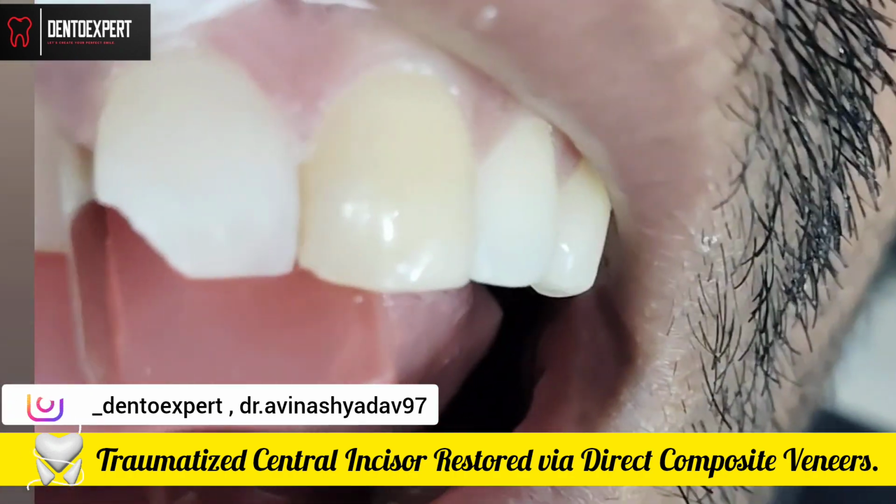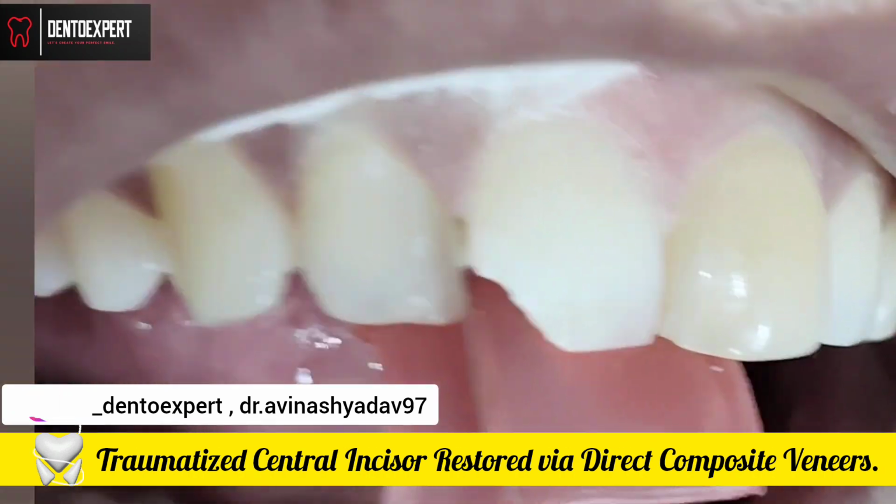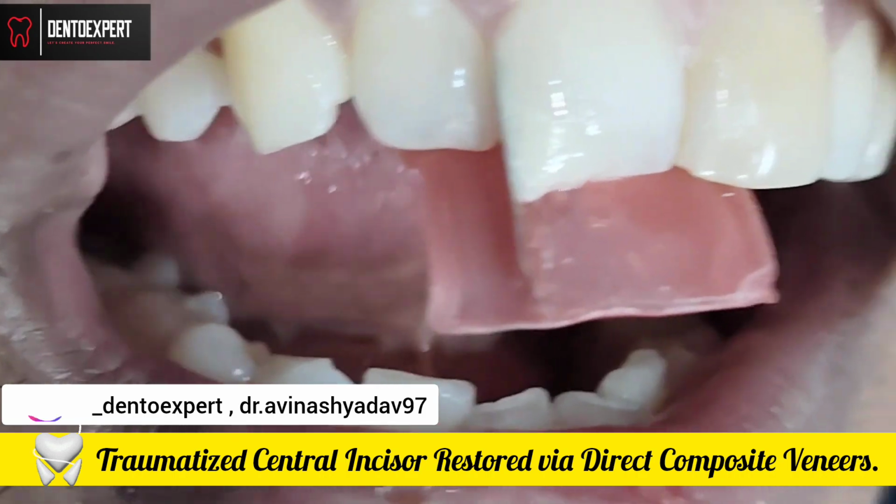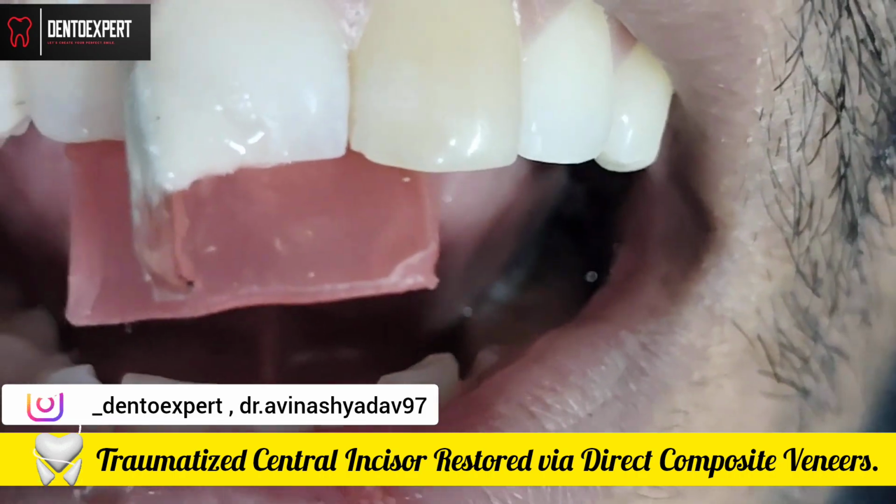Now we will etch the tooth and adapt a wax sheet, or you can use a putty impression and bend it to separate the tooth from the other tooth.